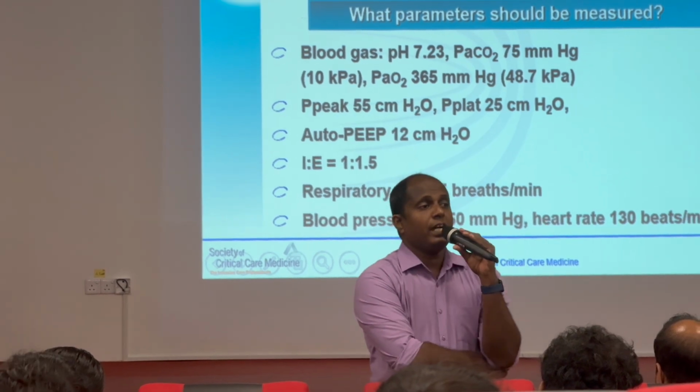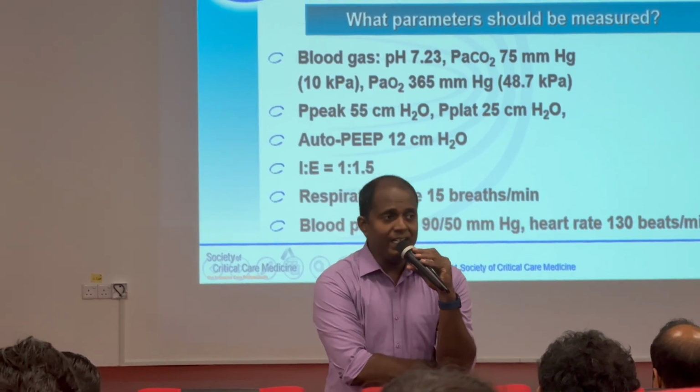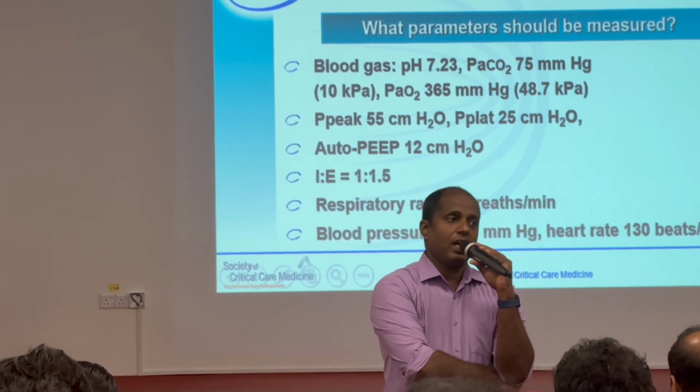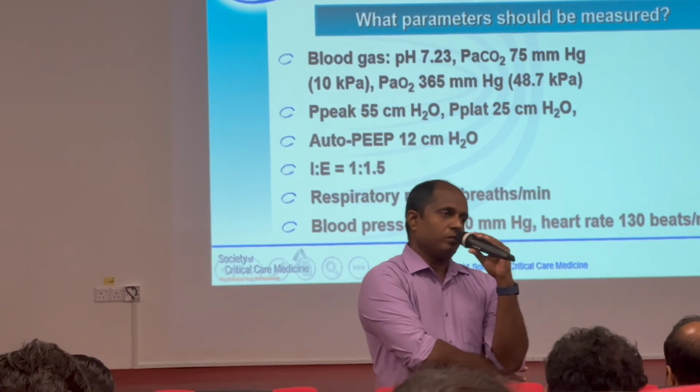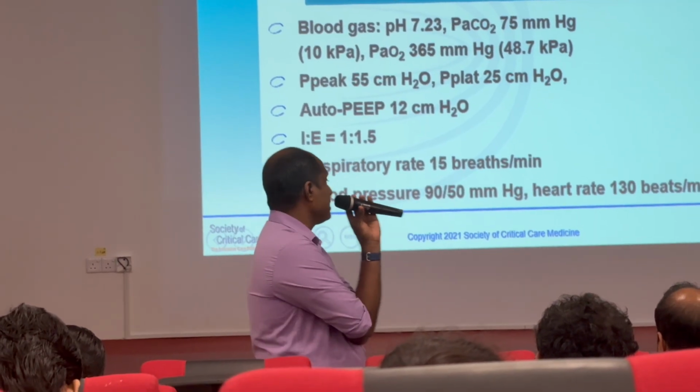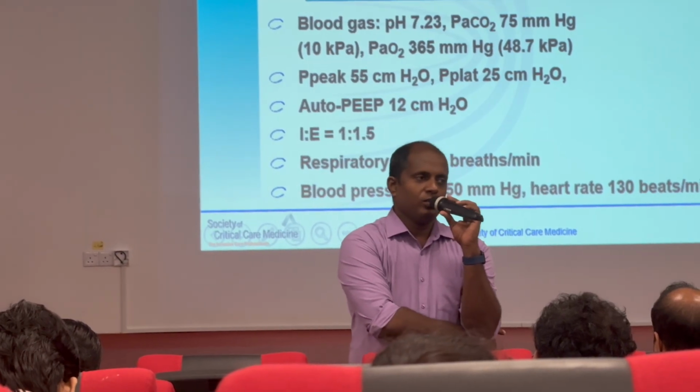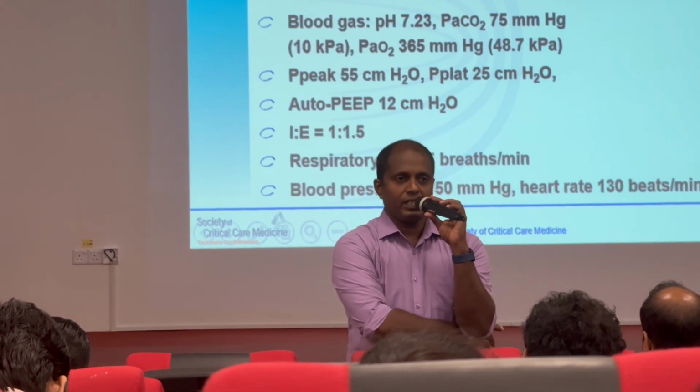You need to reduce the tidal volume. If you are giving more air in for the breaths, it will stop. So you need to reduce the tidal volume as much as possible within your possible chance, and then if everything fails, you need to disconnect for some time and then connect.